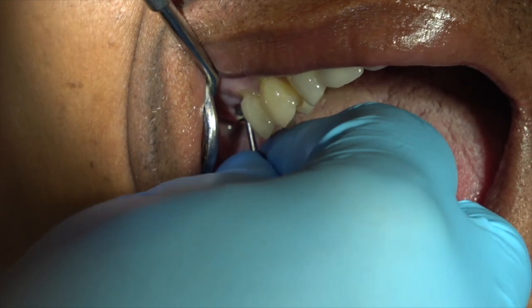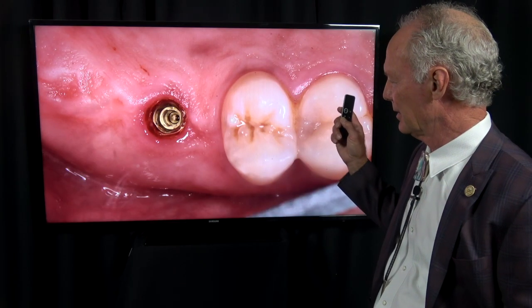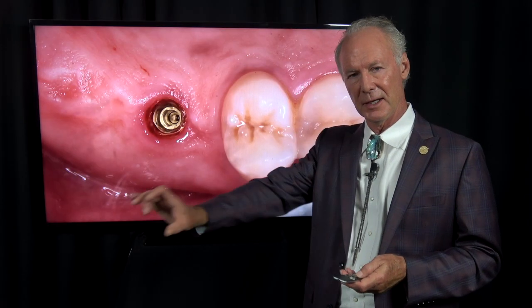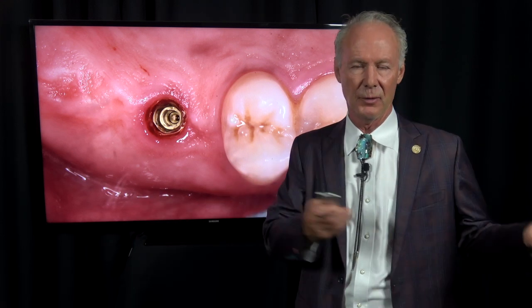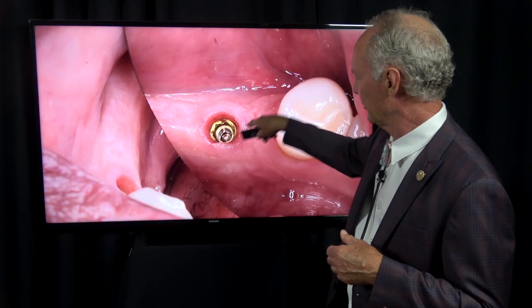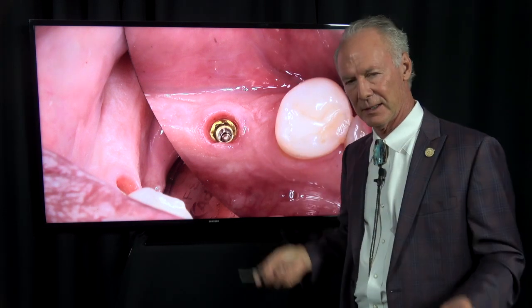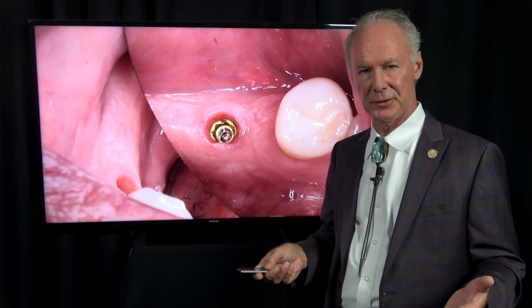I'm unscrewing the healing caps — I like the long healing caps. If I'm not extracting a tooth and it's in an edentulous area, I prefer not to reflect a flap. I just take the pilot drills through the soft tissue into the alveolar process. That way you can create an emergence profile with the healing abutment while the implant is osseointegrating, and the patient doesn't have to deal with stitches. I prefer to go straight through the soft tissue unless I'm extracting a tooth at the same time.